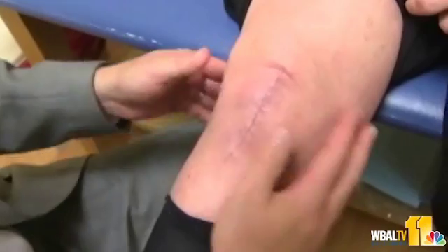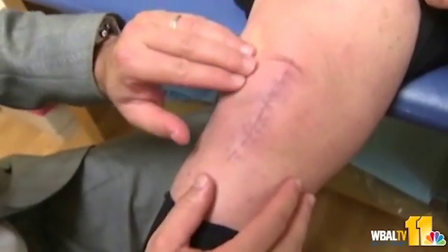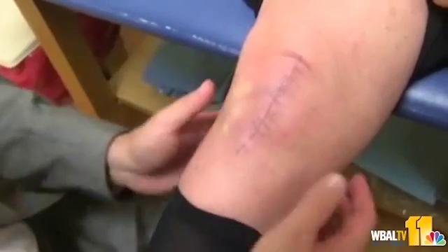Essentially what we're doing is we are replacing the worn, damaged, and missing cartilage with an implant made out of metal and plastic. It's almost like capping a tooth — the basic structure of the knee remains: most of the bone, the ligaments, the skin, the nerves, the muscles. What we're doing is putting a new bearing surface on the damaged part of the knee.